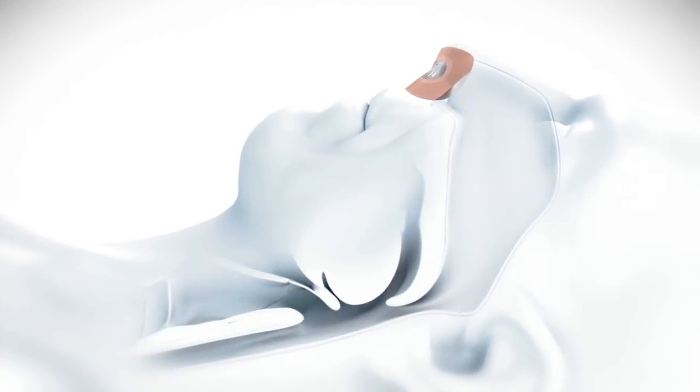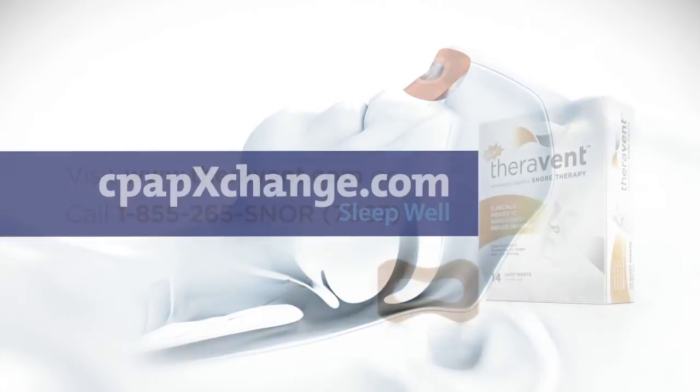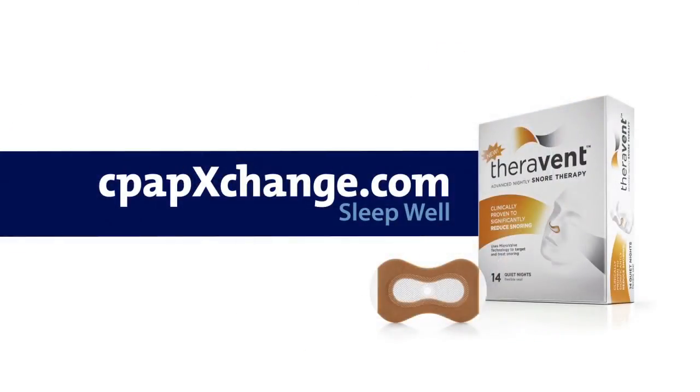This pressure opens up your throat and quiets the vibrations that cause snoring.